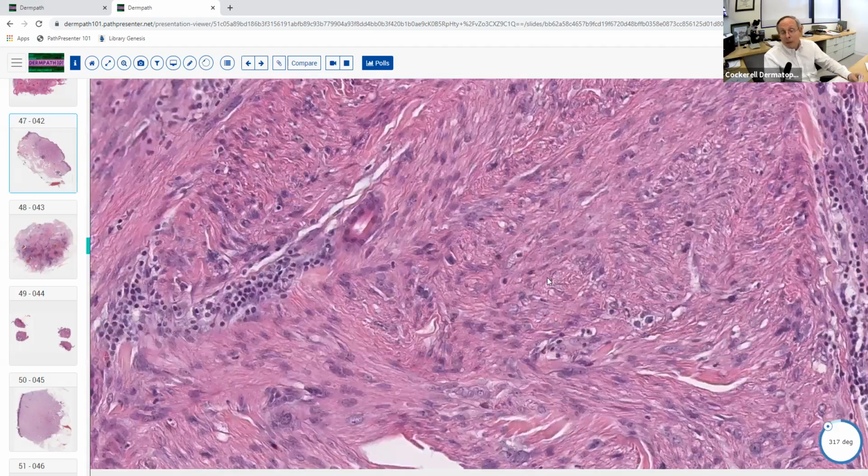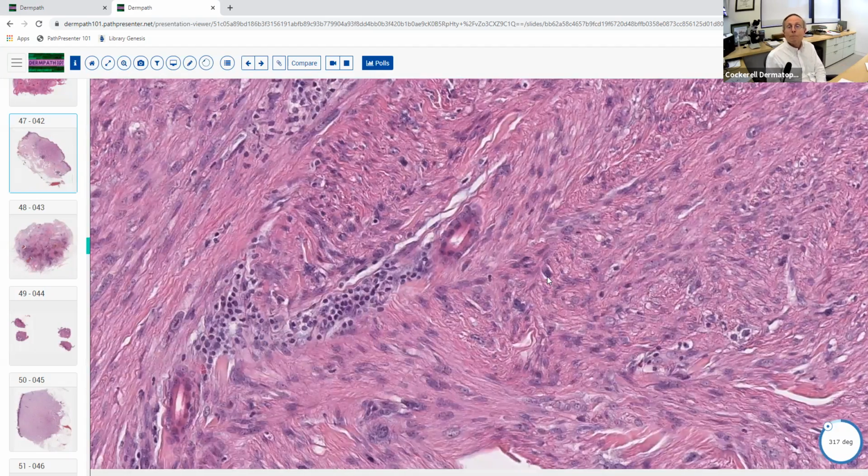Really not even all that atypical because it really doesn't have a lot of mitotic figures, but it's big. And so that might be why it was ultimately called that. And if you see this on the board examination, they're probably not going to give you the differential between leiomyosarcoma and leiomyoma. They really want you to get into the muscle category. So don't worry as much about that. They're not going to ask you to tell the criteria between benign and malignant.